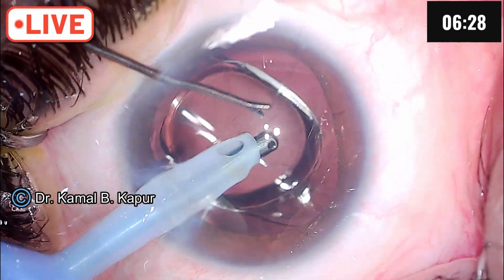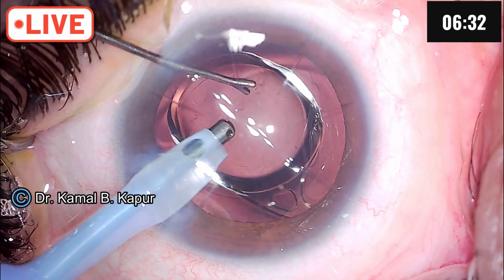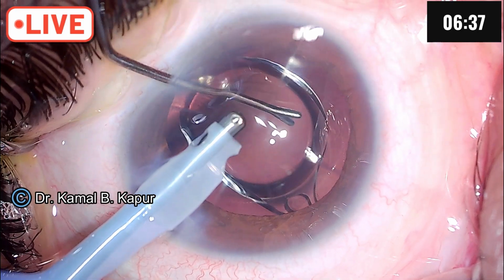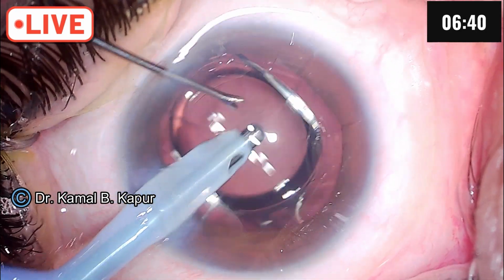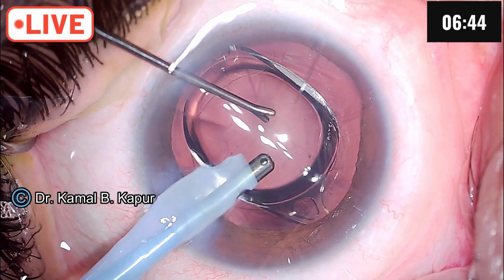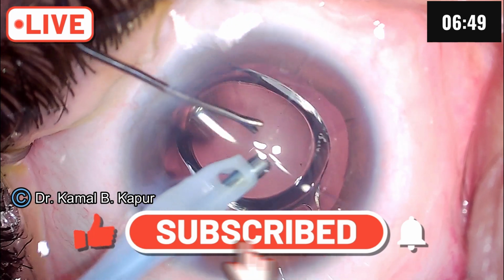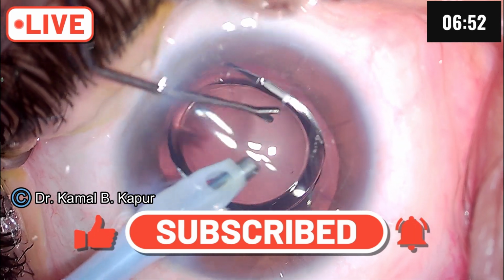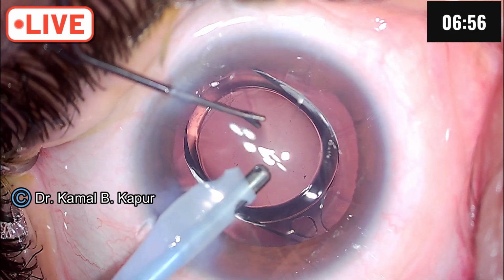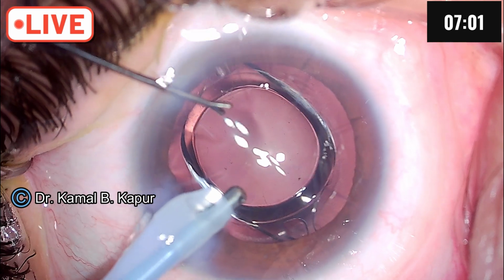These patients also tend to have a lot of surface disorders. It's always a good idea to do their dry eye mapping and estimate the right keratometry before we plan the toric lens because of the corneal incisions. So, treat the surface disorder, especially if you are planning a toric lens. Luckily this eye did not have much astigmatism, so we have not planned a toric IOL in this eye, but the other eye in the patient has got a toric lens, so we will be planning a toric IOL in the second eye.